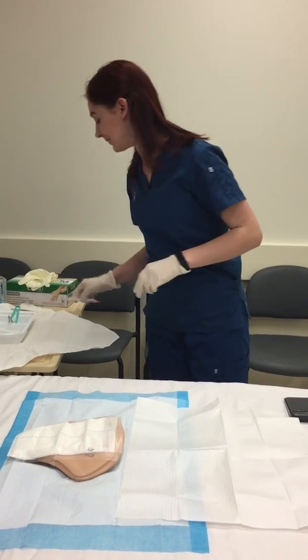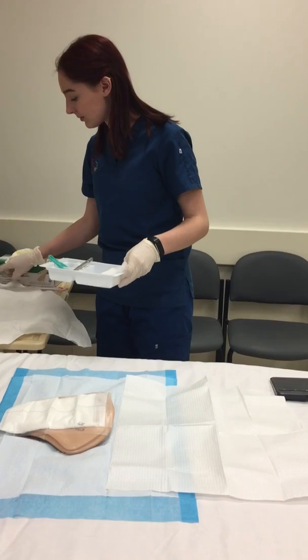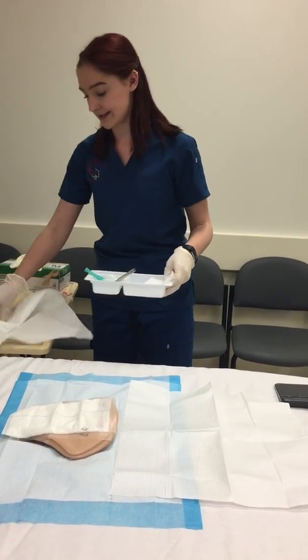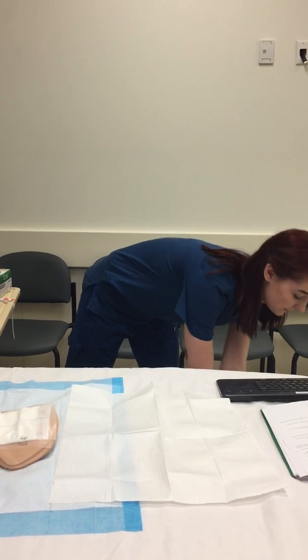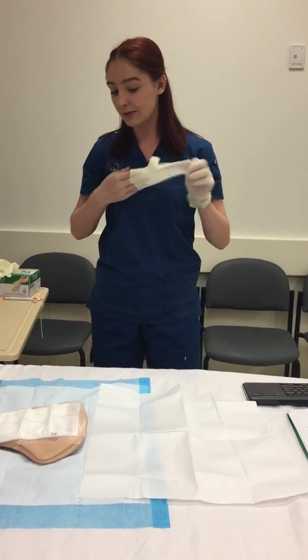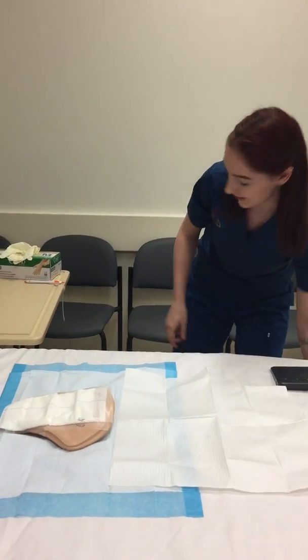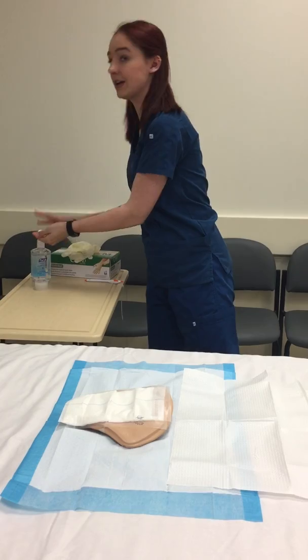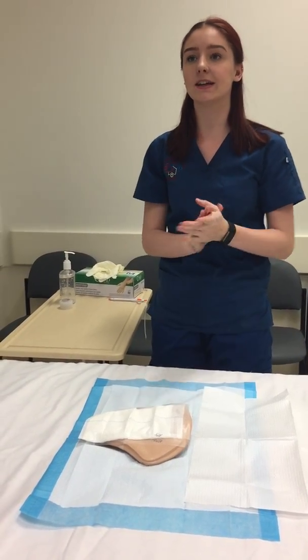And so now I am going to get rid of all my equipment here properly because it's not needed as a sterile field anymore. I can just throw it here. And then take off my gloves and perform hand hygiene again. Just double check with my patient, let him see how he's feeling.